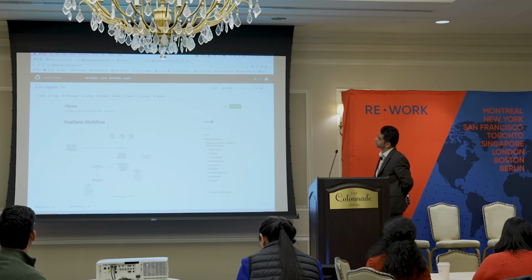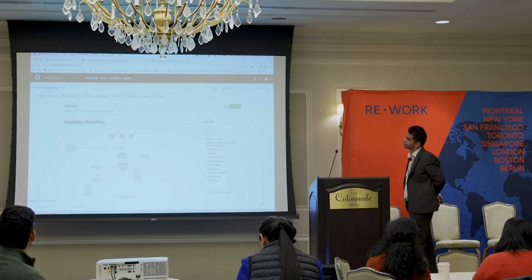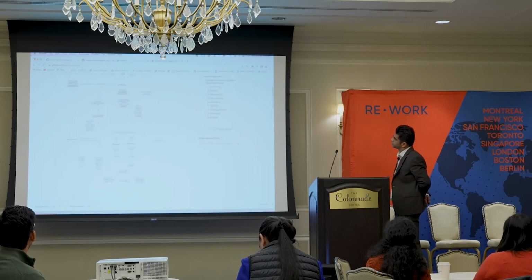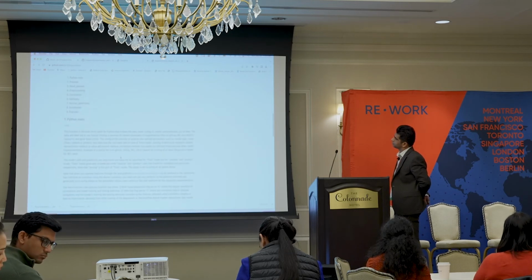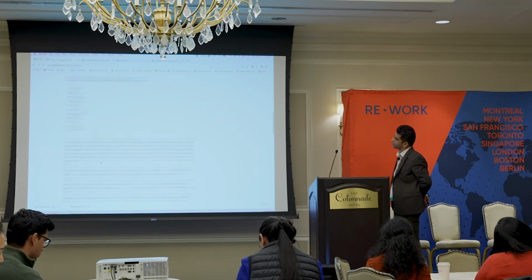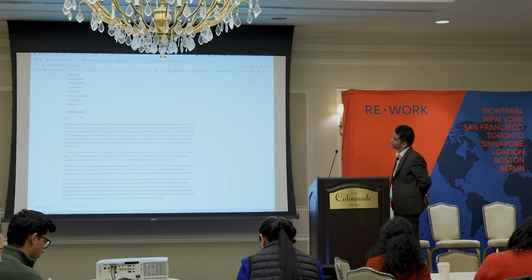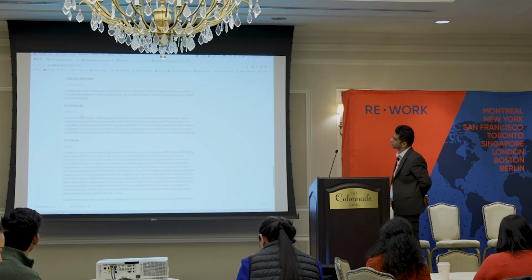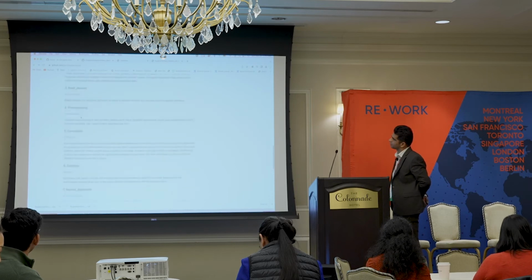A nice wiki exists on ImaGene's GitHub page, referenced in our manuscript. It includes the entire flowchart of the ImaGene workflow that gets performed in the backend, and a description of each of the functions used in the ImaGene scripts, starting with the Python main to the processing, to the normalization, building the model, and evaluating it.